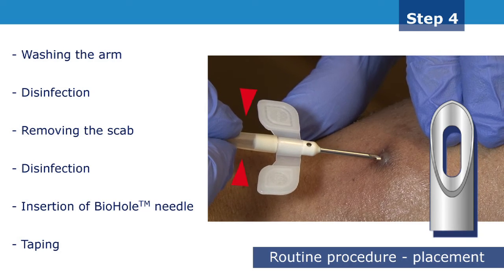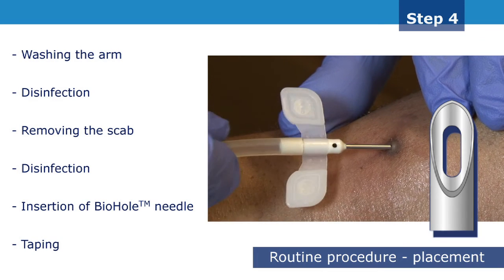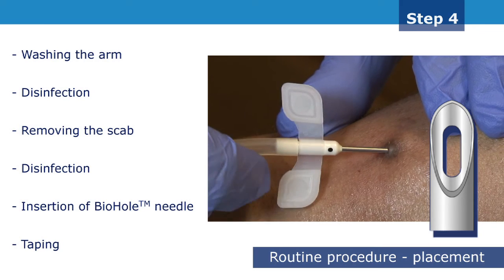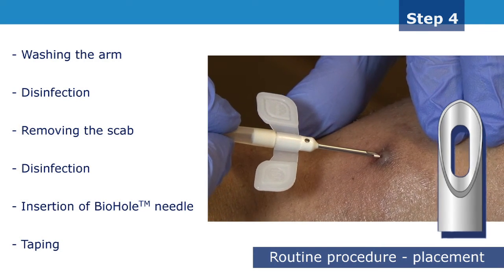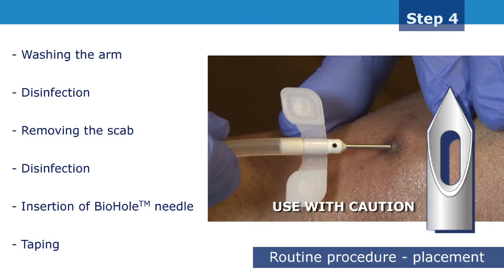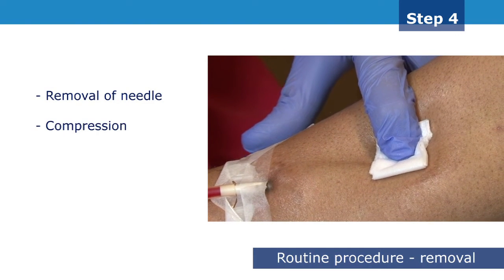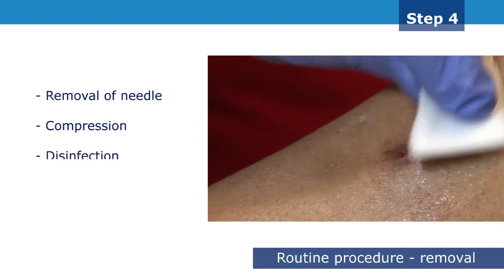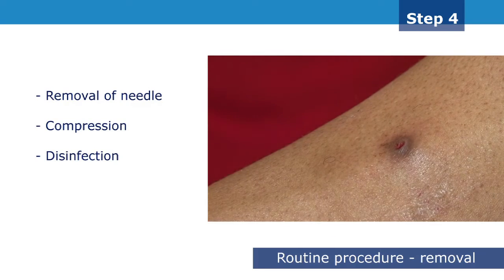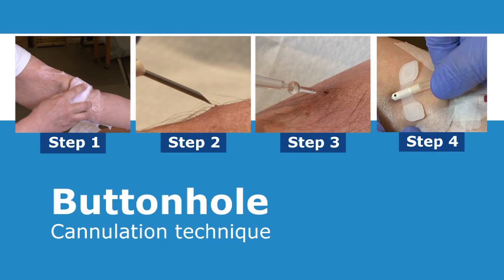If unsuccessful, withdraw the needle, re-disinfect and reinsert a new biohole needle into the same track. Please note that in some rare cases it may not be possible to insert a biohole needle. As a final resort, a sharp needle may be used with extreme caution, since it seriously increases the risk of infection. Remove the needle at the same angle as the angle of insertion. Apply pressure to the site when the needle is removed entirely. Continue by disinfecting the cannulation site and finally cover with a dressing. Some guidelines suggest that topical antimicrobial prophylaxis may be applied to the buttonhole sites after dialysis.